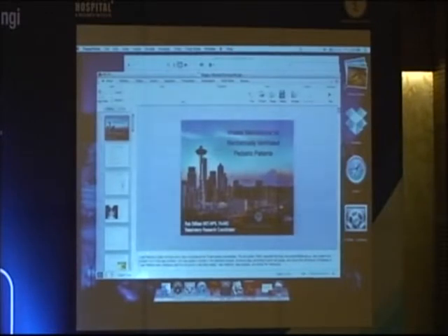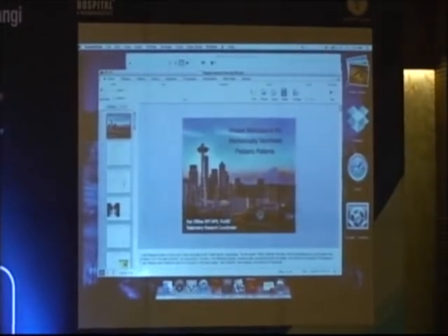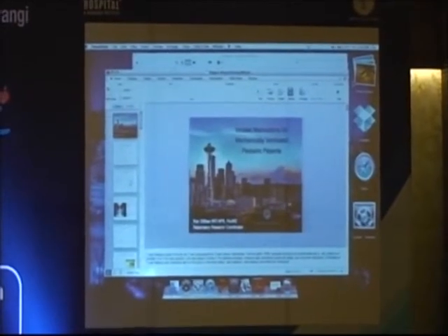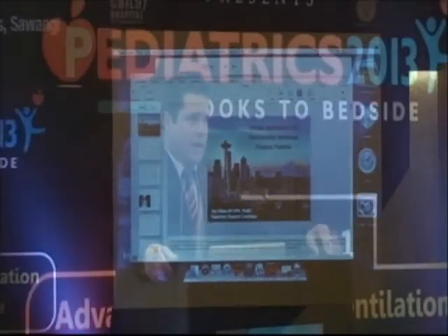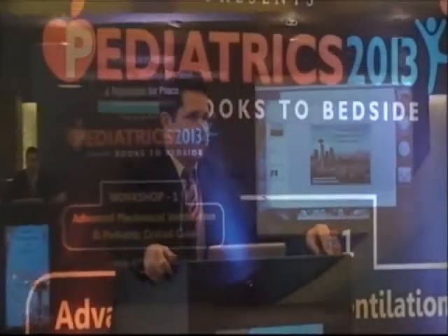We've worked with the Bill and Melinda Gates Foundation to try to make this a form of surfactant that in time we may be able to make available to people in resource-limited settings at 30 or 40 cents a dose instead of $1,000 or $1,200 a dose. And it's basically ExoSurf. You've probably heard of that. It's a synthetic form of lung surfactant. And so we're going to evaluate in spontaneously breathing animals receiving CPAP drug delivery using this drug, but also using one of those Aerogen nebulizers that don't add any additional flow to the system.